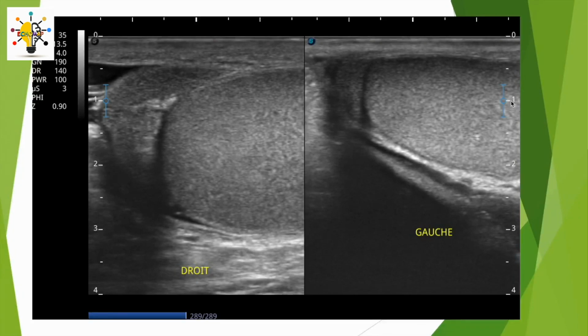As you can see, the cuts are made on the same scale. You can see that the scales fall to the same height. Because if you change your depth scale, you can no longer compare left and right. Sounds simple enough, but I'd rather remind you of that in this video. So anyway, a fairly rich ultrasound scan overall.